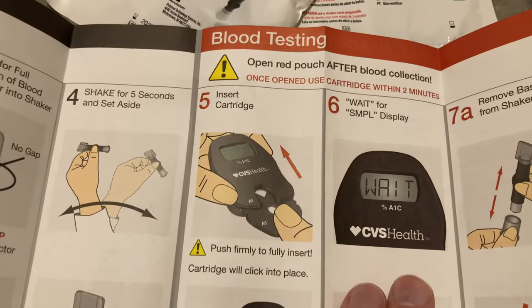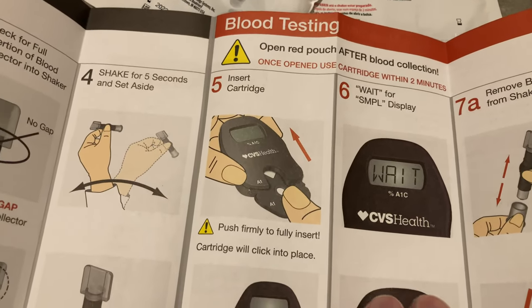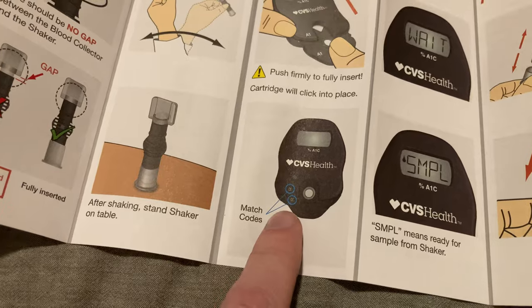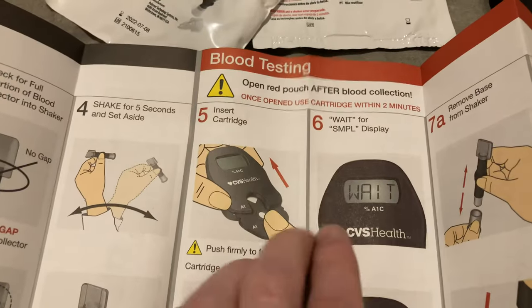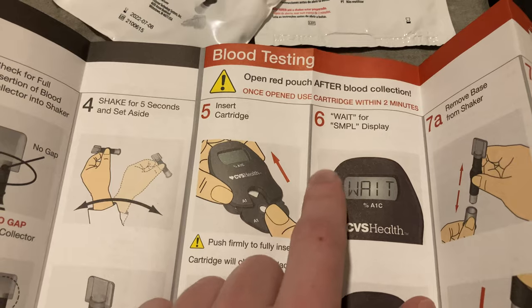All right. Now you're going to take the cartridge out of its package and insert it fully into the machine. It'll make a click when it's in place. You're going to check to make sure the codes match here between the machine and the test. And then the display will display wait and sample.